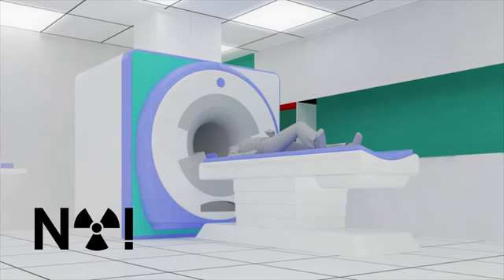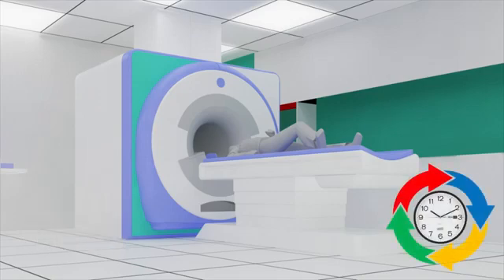Magnetic resonance imaging, MRI, is a non-invasive way to view organs and does not use radiation. It gives extremely clear, detailed images of soft tissue structures. But on the other hand, MRI examinations are long because it is necessary to acquire sufficient data to build a complete image.